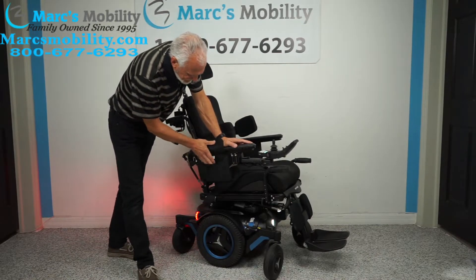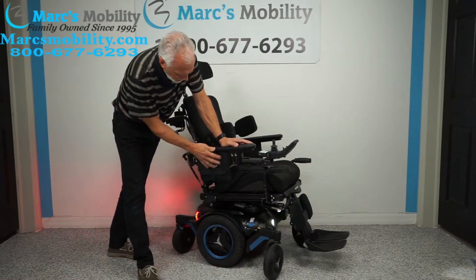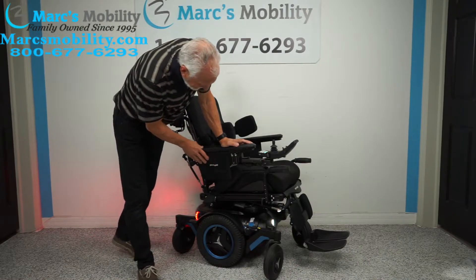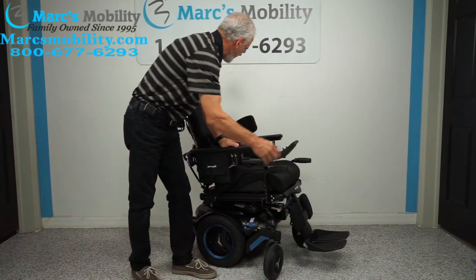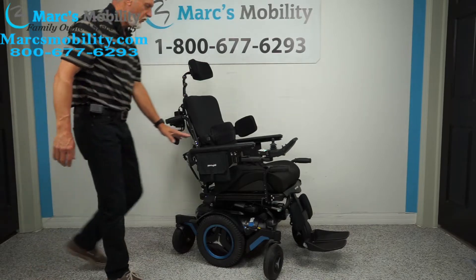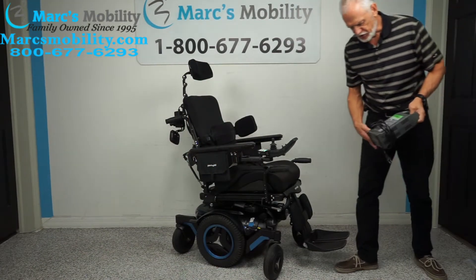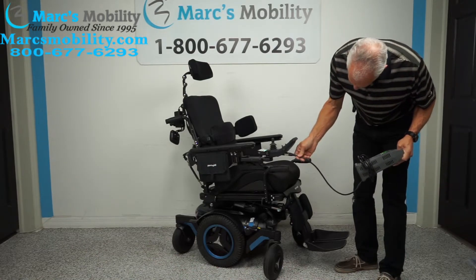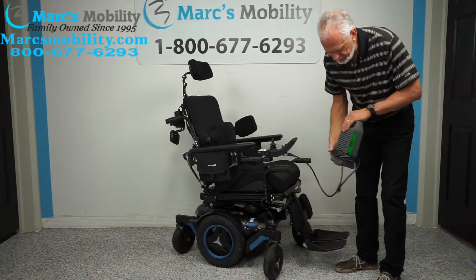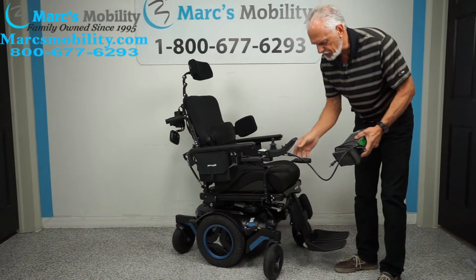You have two bags, one on each side, for your glasses or cell phone — Permobil bags already attached. When you charge this chair, you plug the charger right below the joystick, and as soon as the lights go green the charger will stop charging automatically.